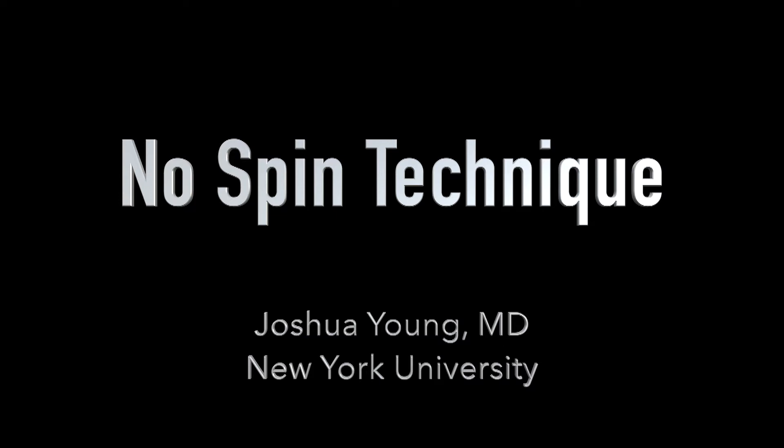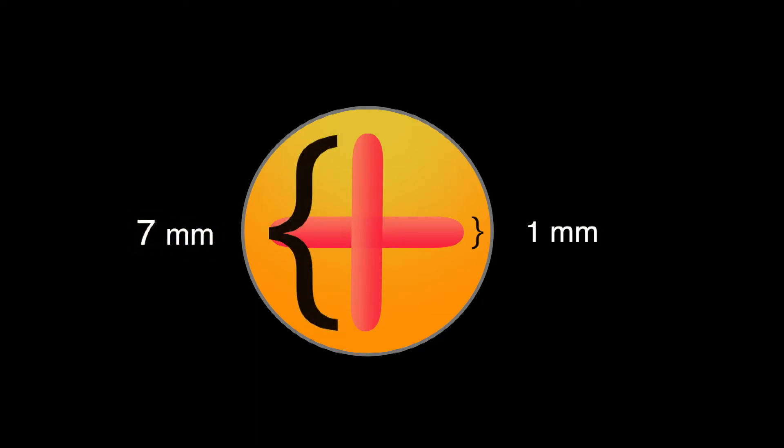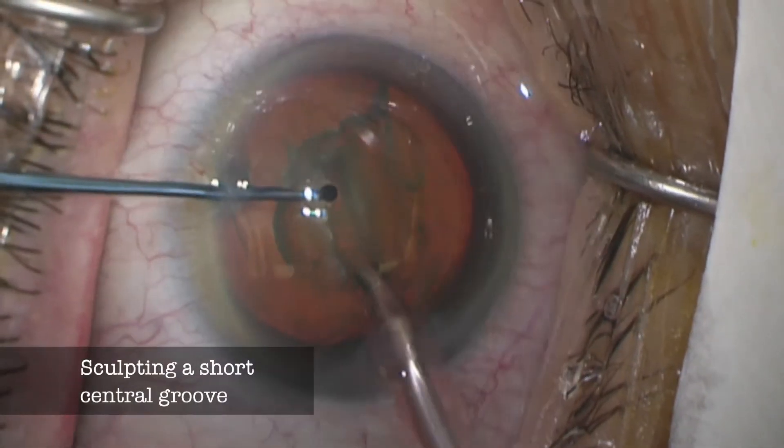Perhaps we should employ a technique that does not call for any lens rotation. I don't like divide and conquer, but it does demonstrate that it's possible to crack a lens with a very short groove. If the width of a divide and conquer groove is about one millimeter and the length of each groove doesn't exceed seven millimeters, then each arm of the cruciate pattern must be no more than three millimeters long. This means it's possible to crack a lens with a groove as short as three millimeters in length. So let's start by making a three millimeter groove right in the center of the lens.